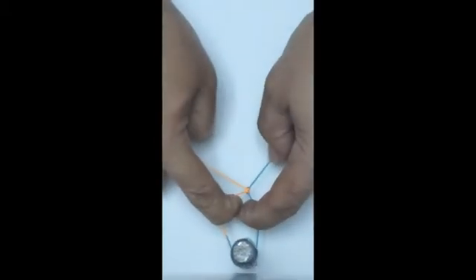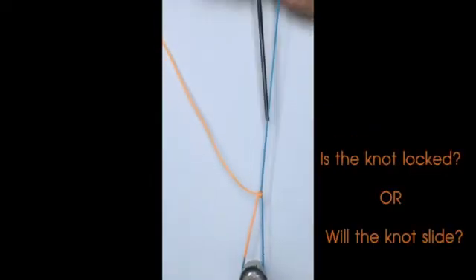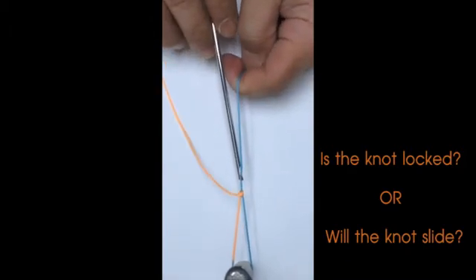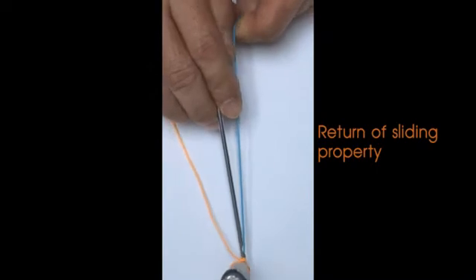The same principle can be used in case of premature locking. Simple tension on the post or the blue limb will easily return the sliding property to the knot.